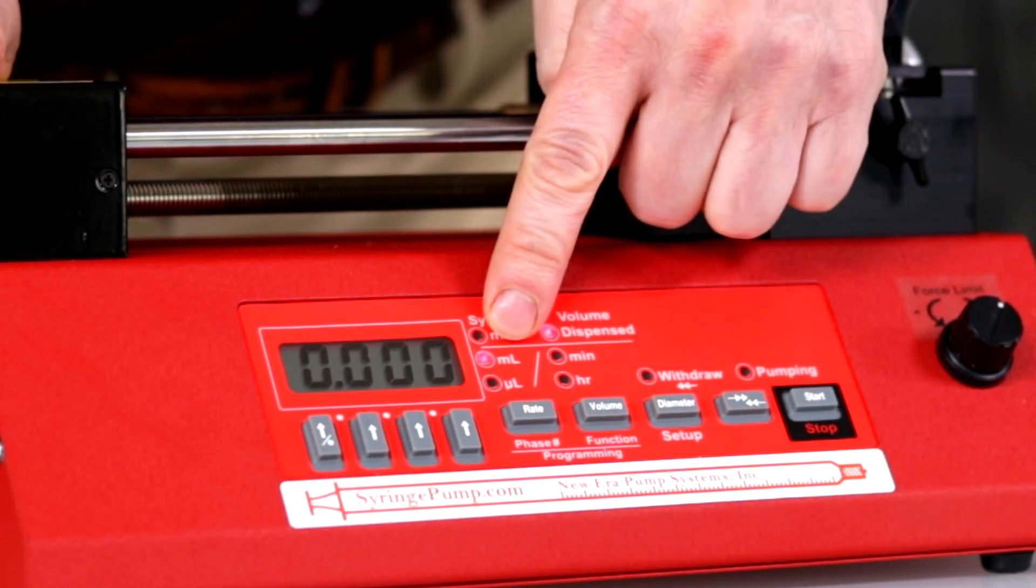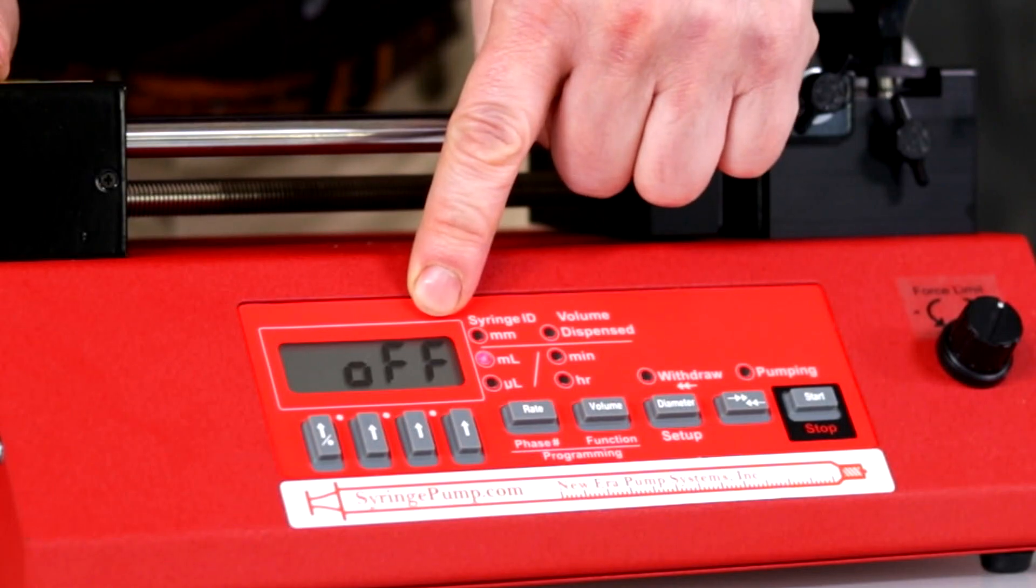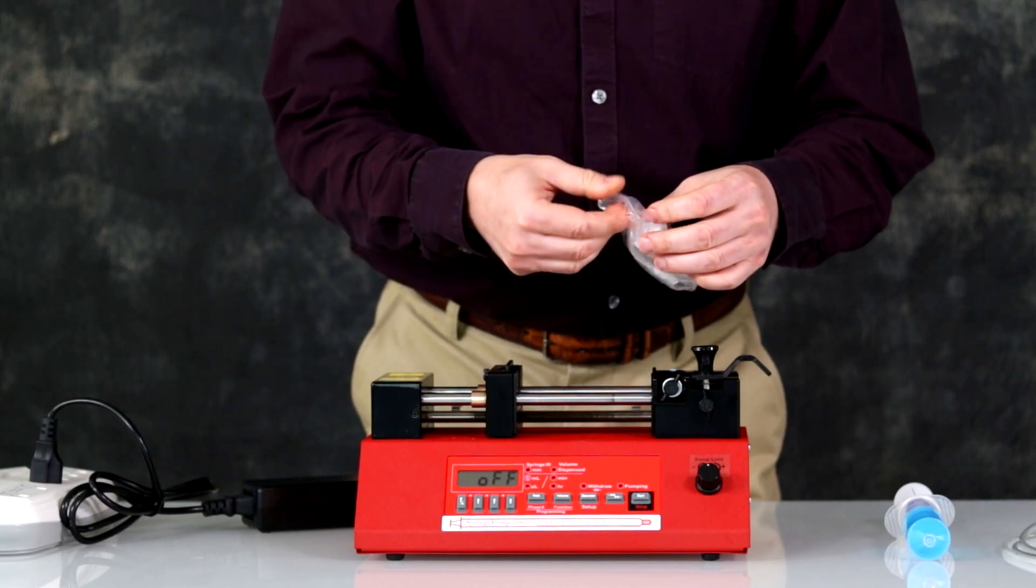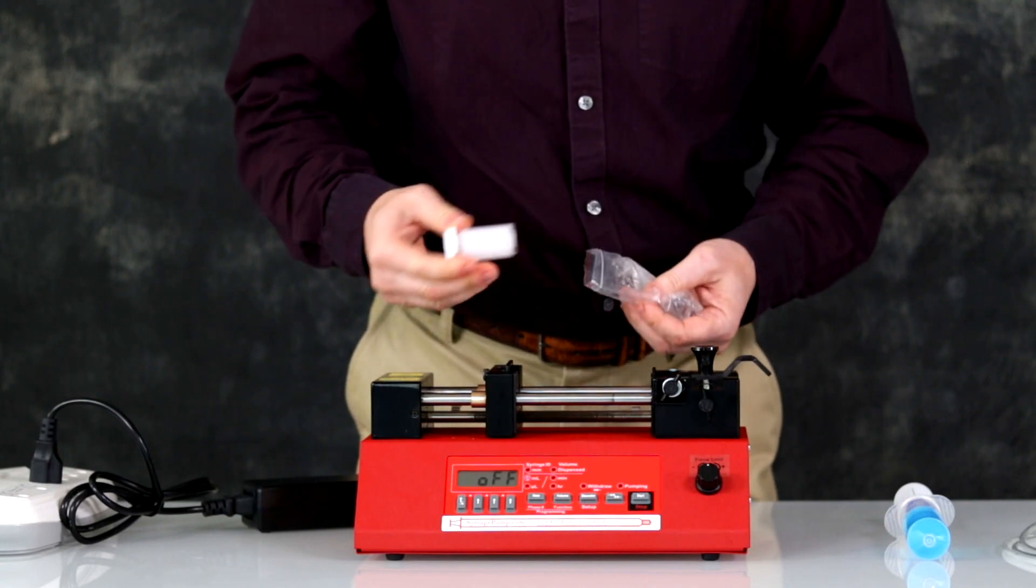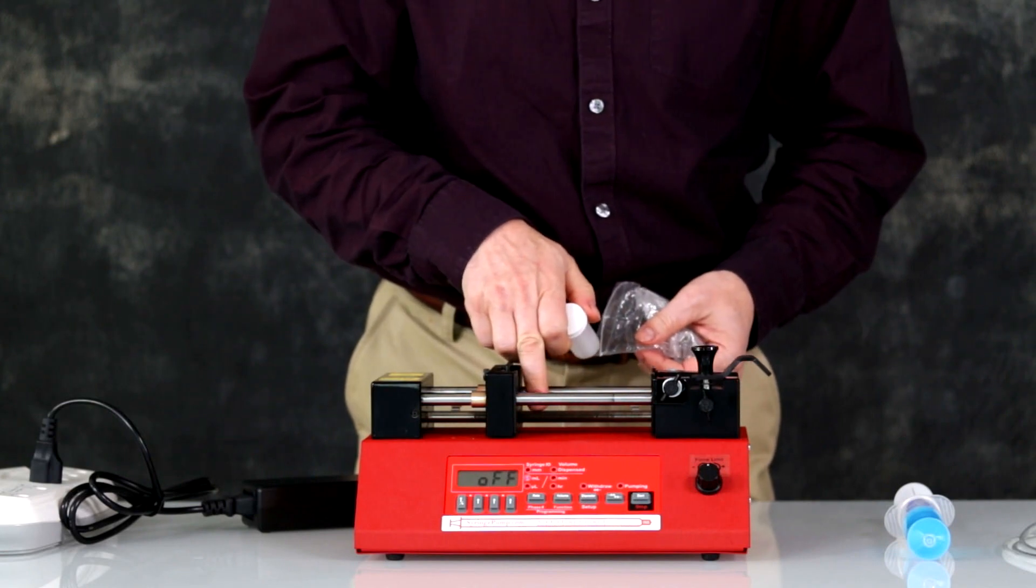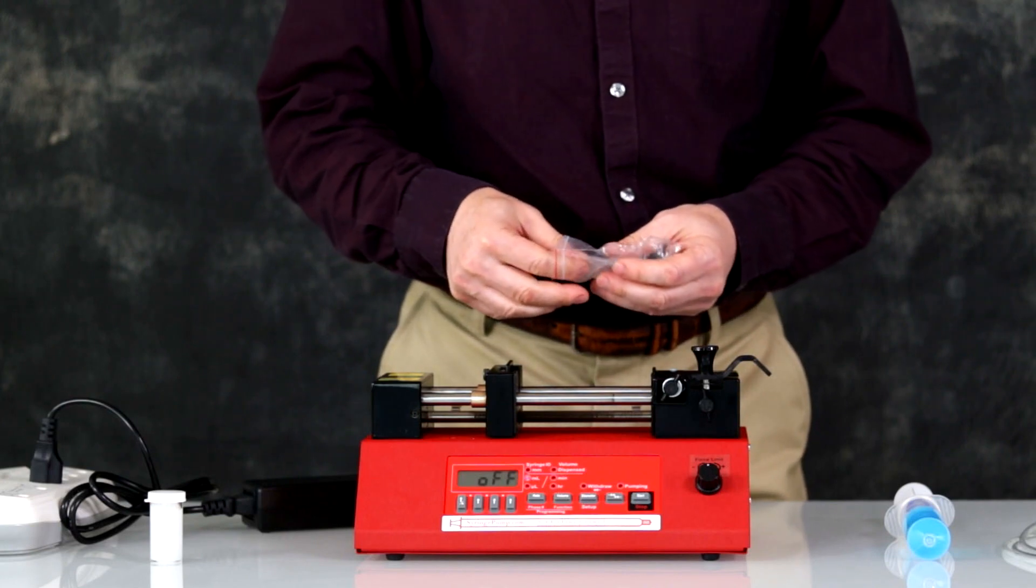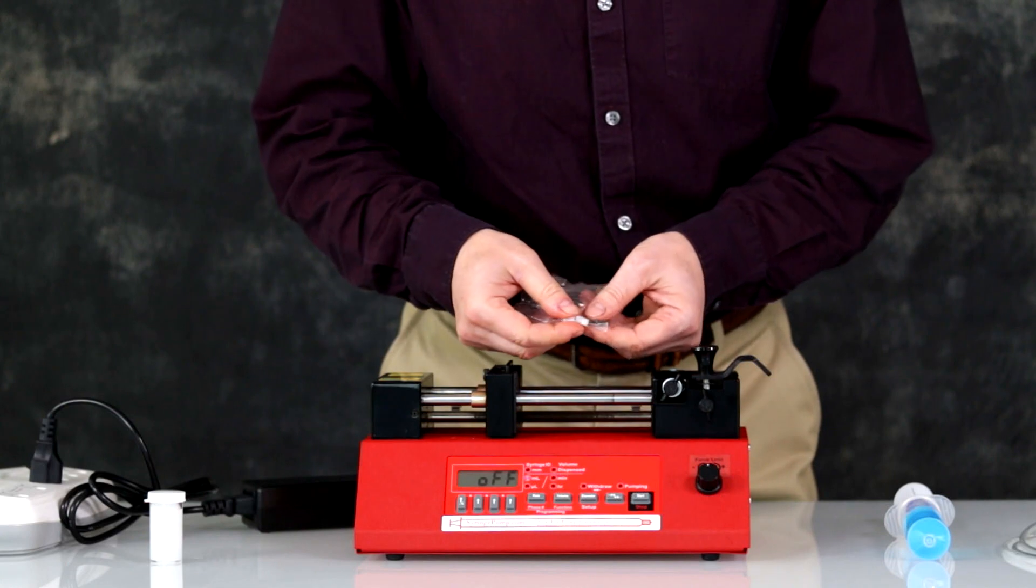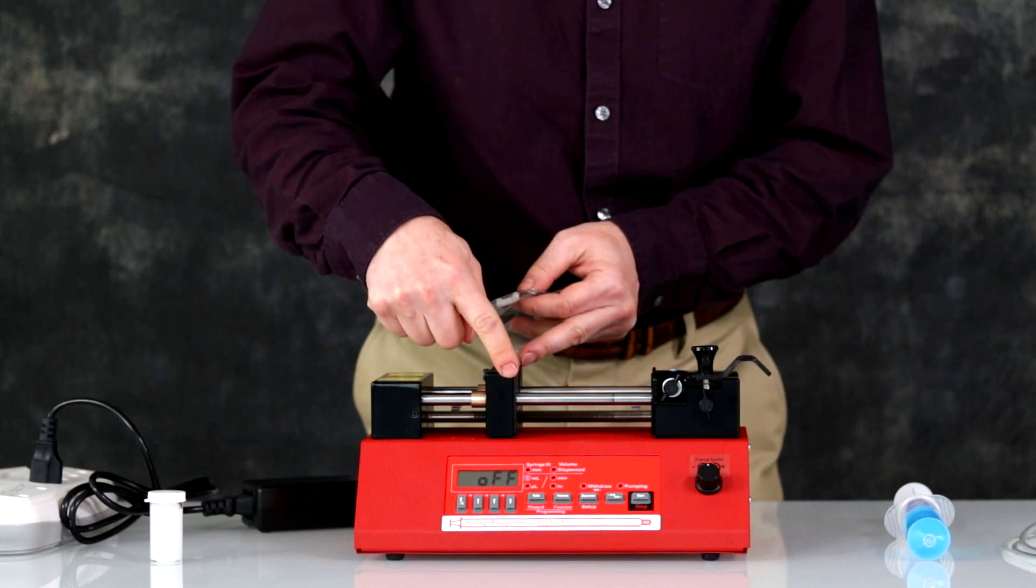NE-8000 included accessories. Included with the NE-8000 is a vial of grease and connectors. The grease is used for lubricating the guide rods and lead screw. Also included are adapters, screws, and spacers for specialized syringes such as stainless steel syringes that need a wider gap.